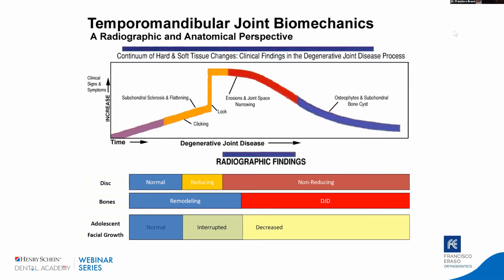If you don't use CBCT, there is no way that you're going to be directed in the right direction with your diagnostic information. So it's extremely important that you use the right information. And the only one that can give you that is CBCT, okay? So let me show you a case.